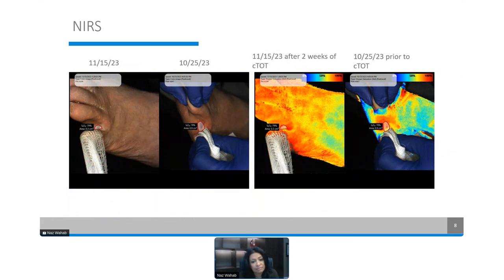And then after 2 weeks of application of the topical oxygen, look at the top of the foot, the dorsum of the foot. Now, I did not anticipate this type of result, but you can see that with just 2 weeks of topical oxygen, we were able to elicit a systemic response. I think this is an important distinction that all of us didn't understand: the topical oxygen directly on the wound is actually doing much more, creating a systemic effect, which is probably why it's working.